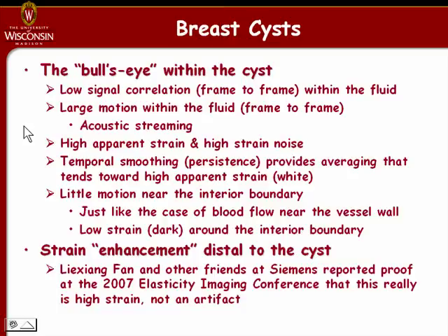We know that if we have a fluid-filled cyst, then we have generally fairly low signal amplitudes, and as a result we have fairly low correlation from one frame to the next for the radio frequency echo signals that correspond to that data from the cyst.